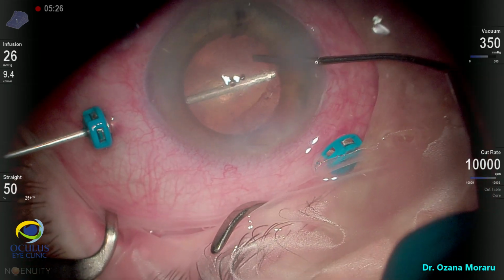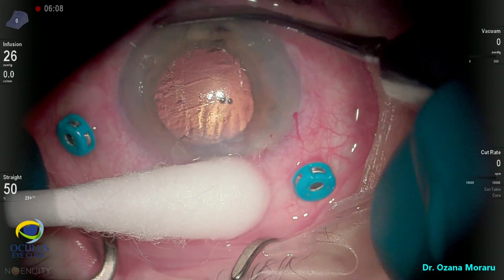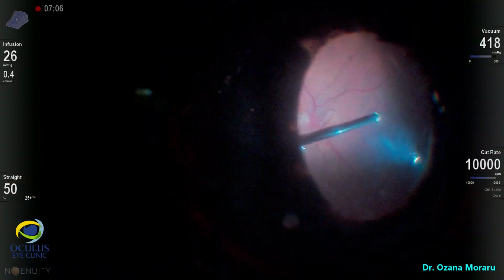So the patient was referred to us with quite an advanced corneal epithelium edema, which you will see we will need to remove in order to see better. And we are preparing for a 3-port 25-gauge vitrectomy.